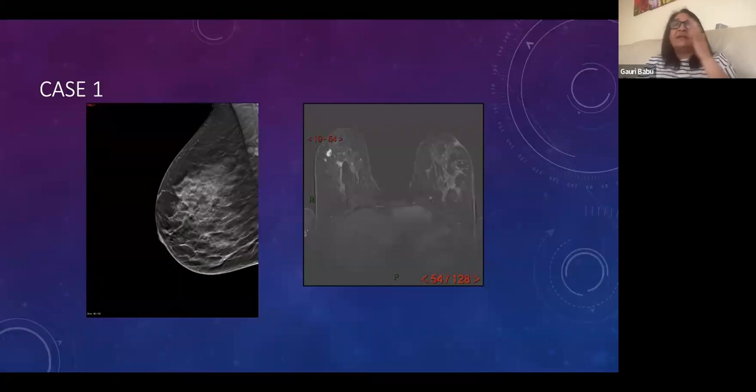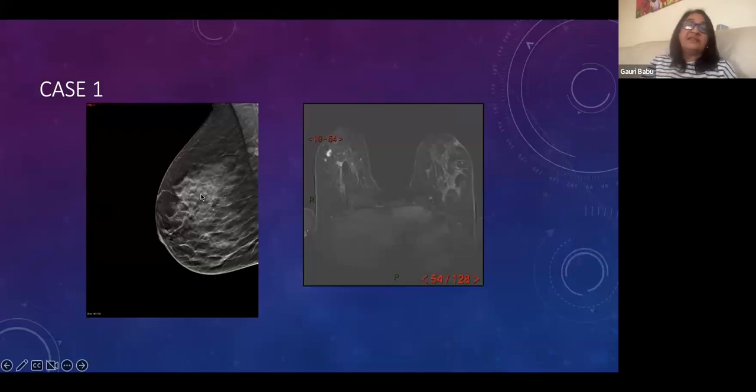Lobular cancers can have a wide variety of presentations. They can be mass-like, or an asymmetric density, or a distortion. If you think about the pathology of lobular cancers, they arise from the lobule of the breast rather than from a duct. So it doesn't have to breach the duct to spread. Sometimes it can be quite insidious and slow growing, but it can be quite extensive. In this case, we saw a spiculate density, a distortion, which came back as a lobular cancer. And like you said, it's one of the indications for doing an MRI.